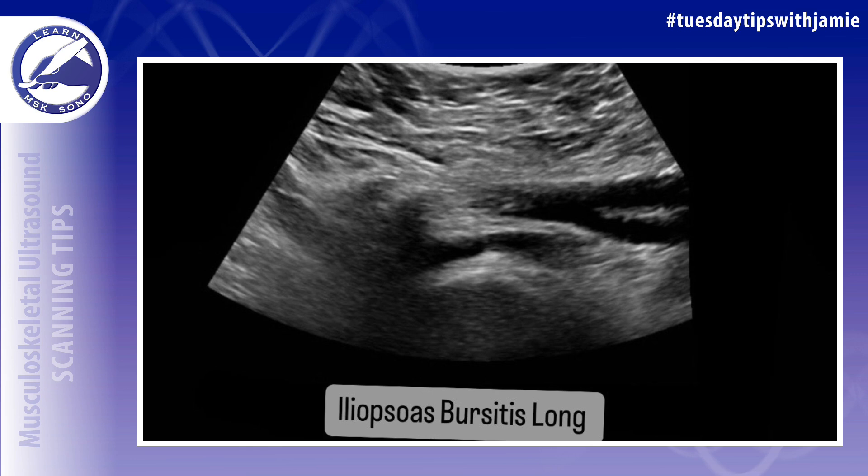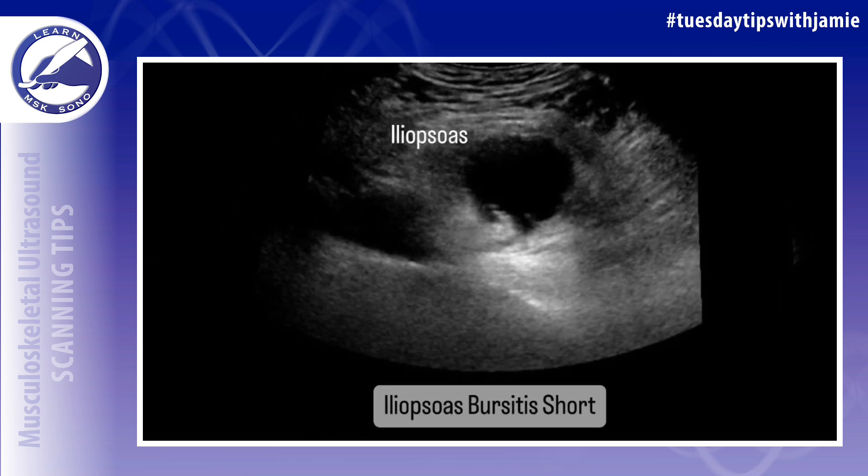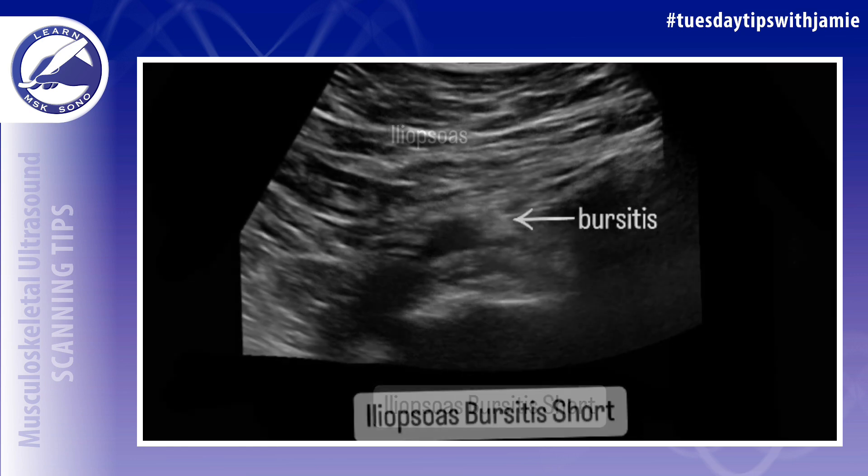When the bursa is distended, it first forms a U-shape beneath the tendon, and as it fills with more fluid, it can track deep to or within the iliopsoas muscle. It is also possible for the bursa to communicate with the hip joint.